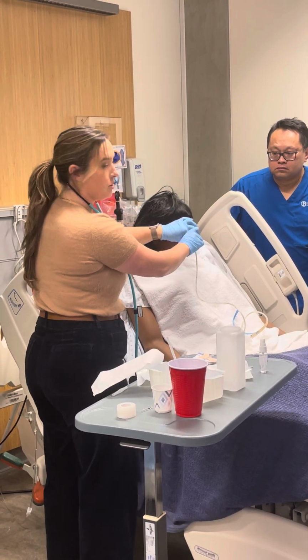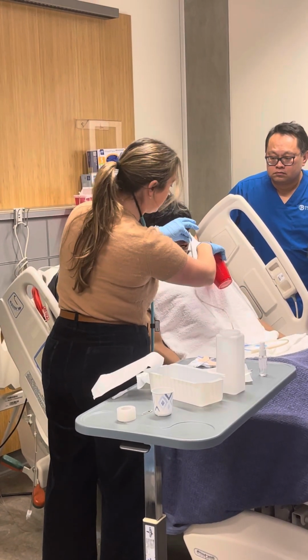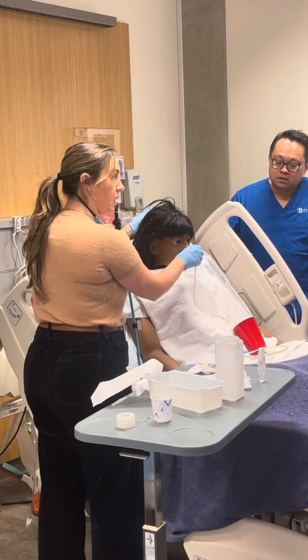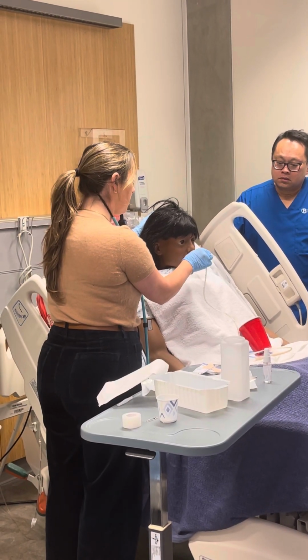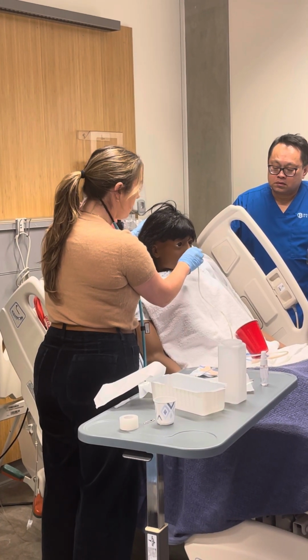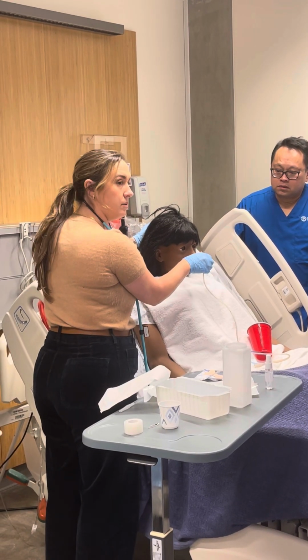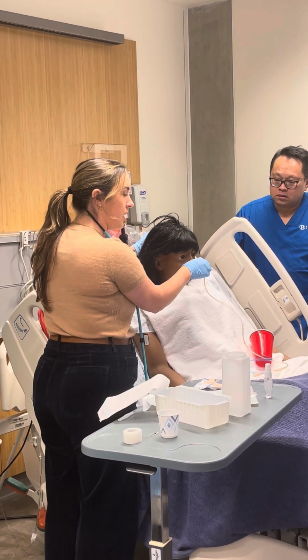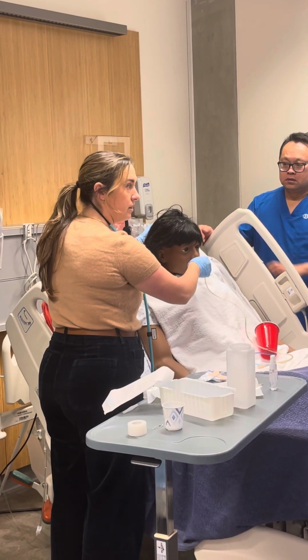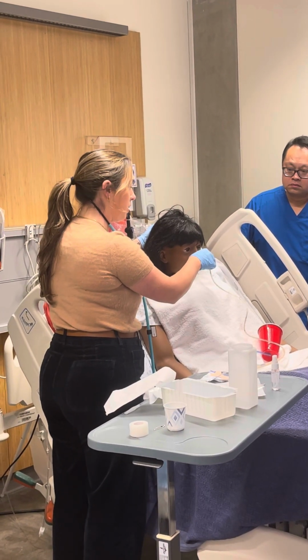If Tran was able to swallow, I'd have her holding this cup and taking sips of water as I was doing this. This is where I would really want to make sure she's taking the sips of water. Okay, go ahead and swallow, swallow, swallow for me. Keep going. Keep going. If you feel some resistance, you can do a little bit of forward with your wrist, but again, do not engage your bicep because you don't want to puncture the esophagus or the lung, right?